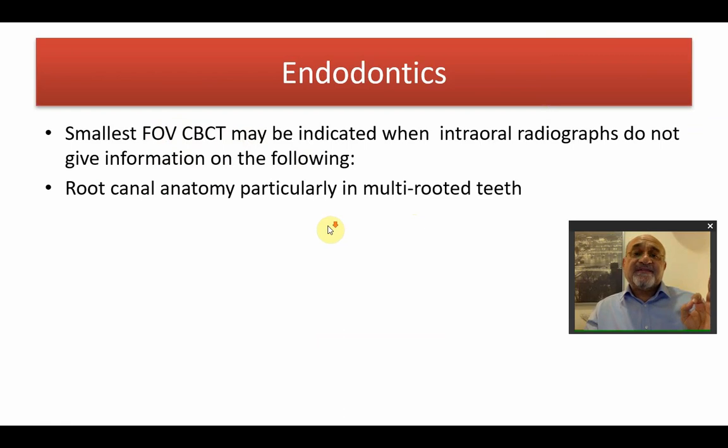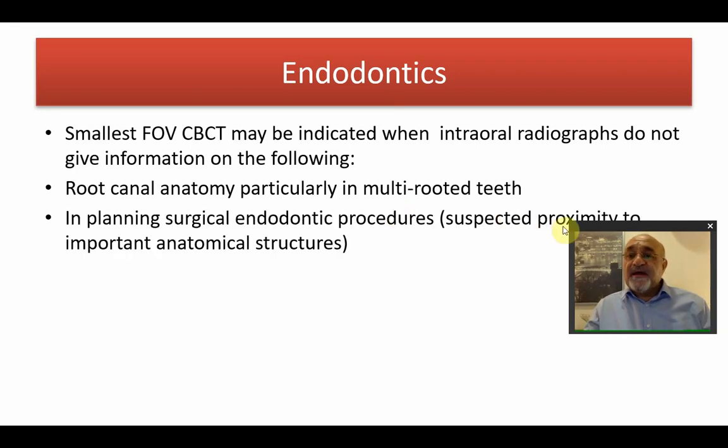In cases like root canal anatomy, especially in multi-rooted teeth, where you feel that it's almost very difficult to view the anatomy.